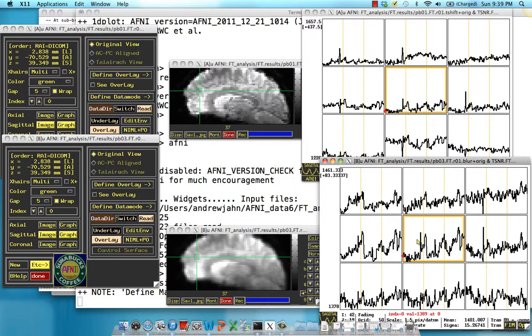The default in AFNI is to apply a smoothing kernel, an average space of about 4 millimeters. You can increase or decrease that. The benefit of increasing spatial smoothing is that you'll theoretically reduce more noise and increase more signal. But on the other end, you could also be averaging in voxels which really have nothing to do with the signal of interest. This is particularly important with subcortical structures and also with parts near the edge of the brain.